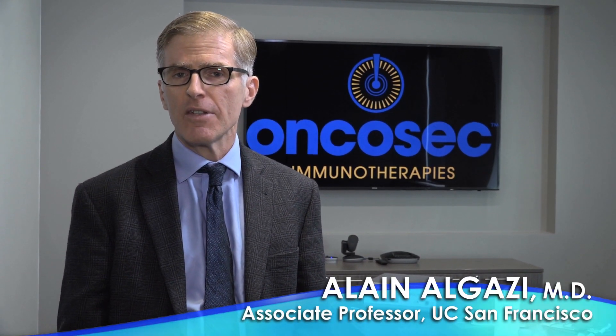I'm here at Oncosec's office in San Diego, California, to demonstrate how the Immunopulse technology works. This is a method for generating a whole body immune response using local injection therapy. I'm going to show you how the technology works by injecting and electroporating the company CEO, Dan O'Connor.